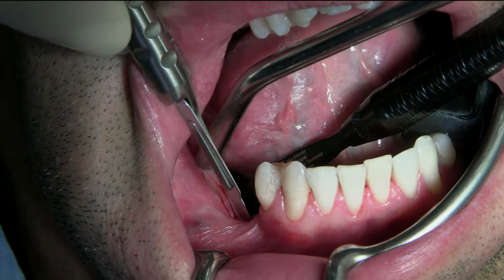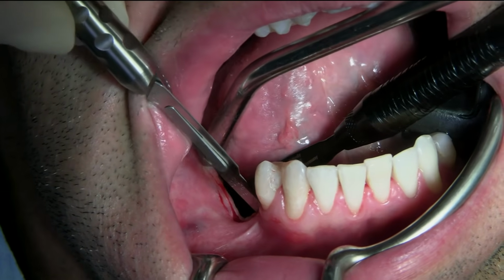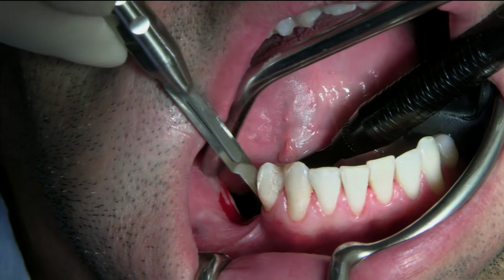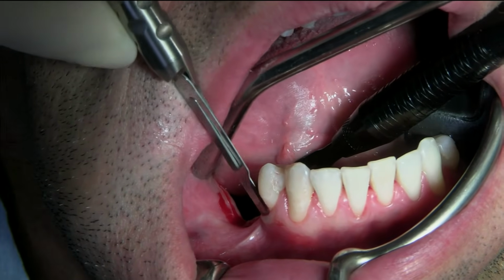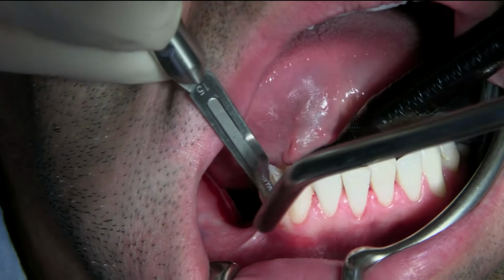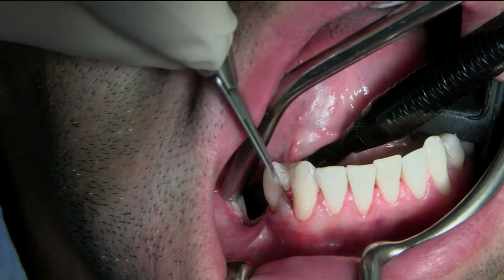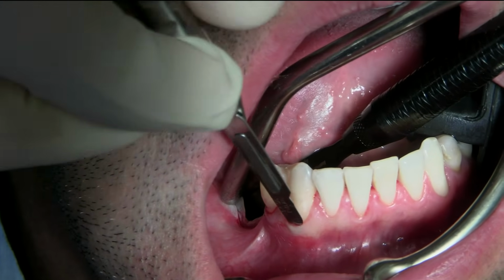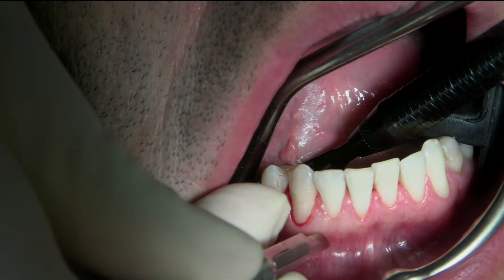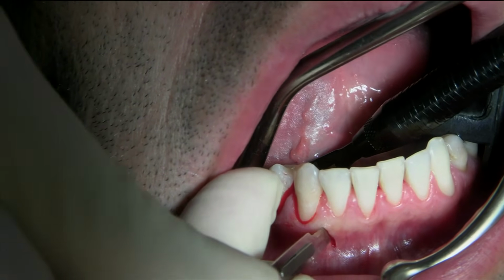Now going anterior up the ridge towards the natural tooth. Sulcular, elevating the papilla, and then making a vertical incision, slight diagonal.